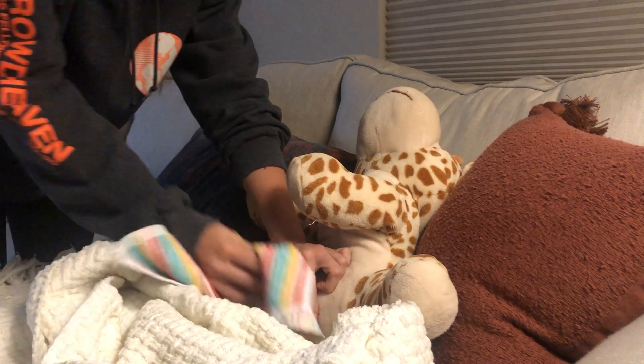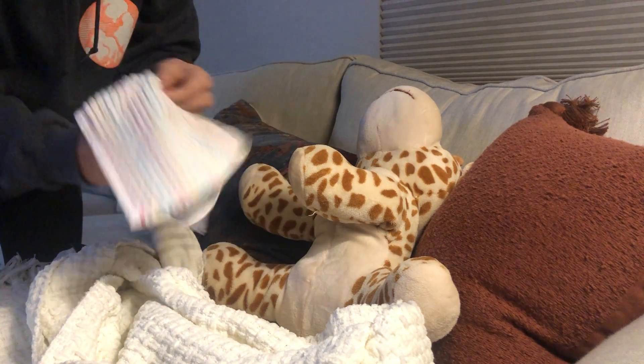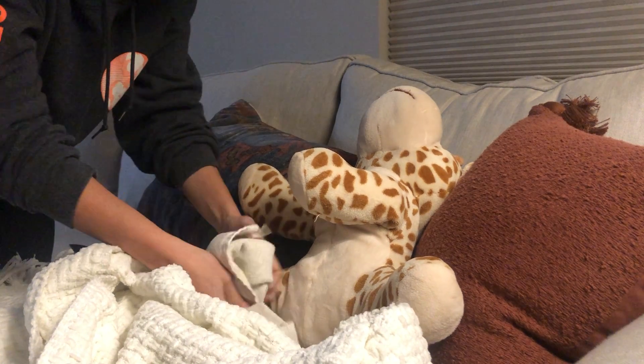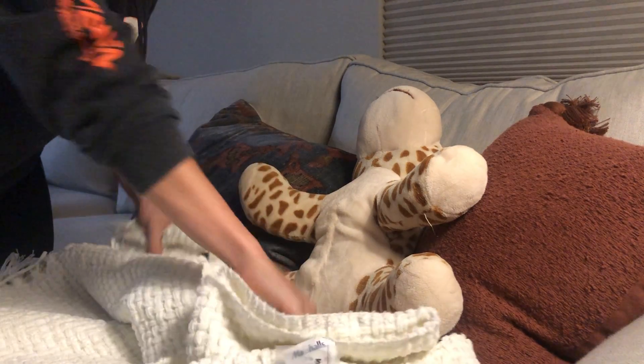Then I'm going to use another washcloth to dry. Holding the catheter at the meatus, I'm going to dry the catheter, and if I want to I can flip and dry again.